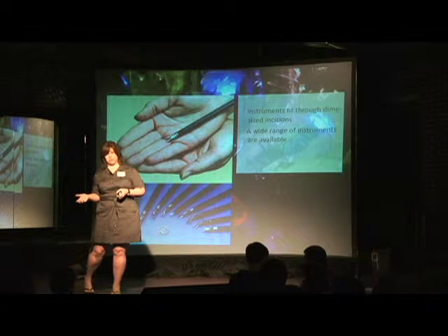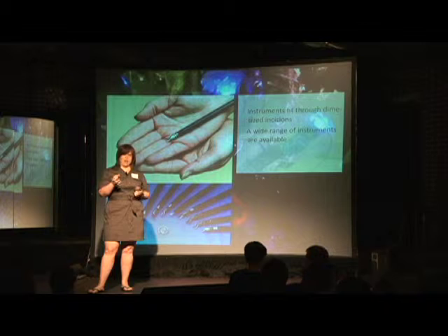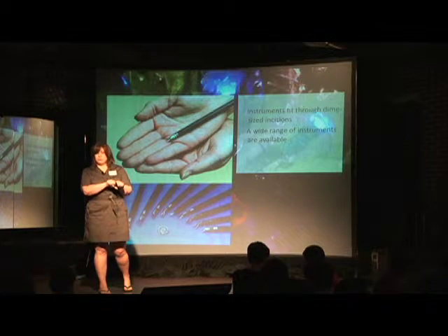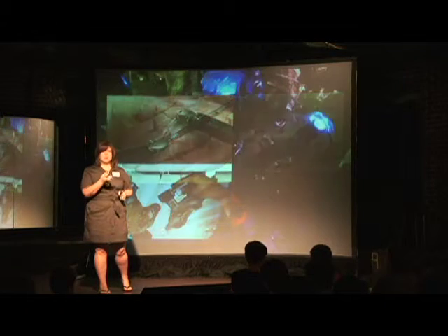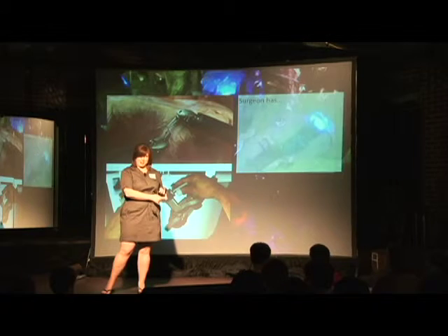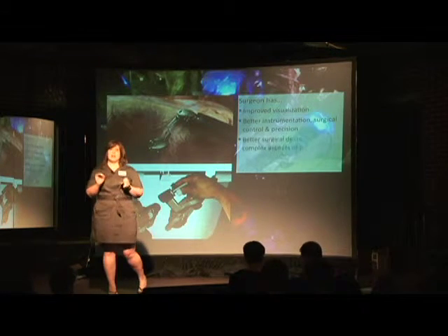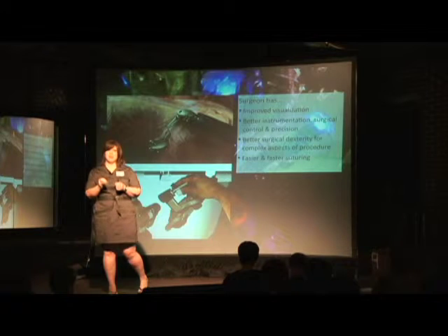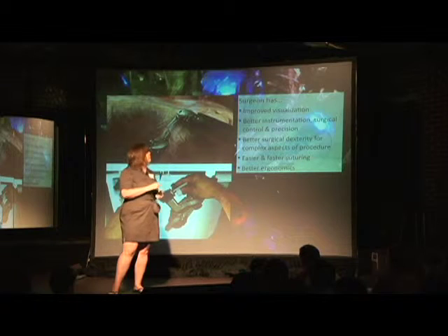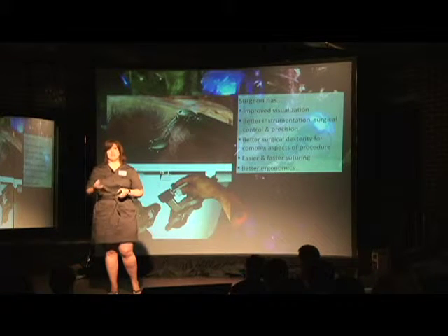Take prostatectomies, for example, when we take the prostate out of someone due to prostate cancer. You not only have the prostate and urethra to connect, which is a very small tube to begin with, you have a large set of nerves that bundle around the prostate that control important things like erectile function and your bladder control. So if you don't have minute abilities to control that, you often have people come back with a lot of issues. With robotic surgery, you're seeing that minimized. A lot of guys are having normal lives after taking their prostates out.